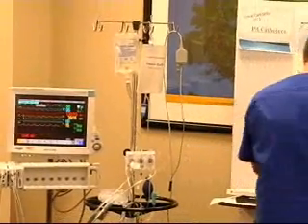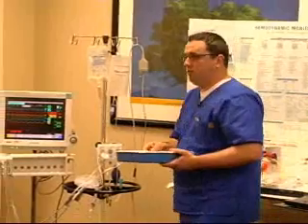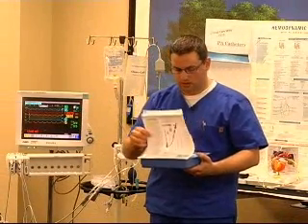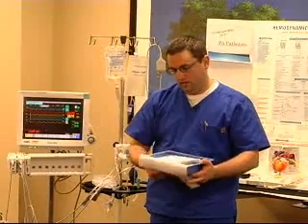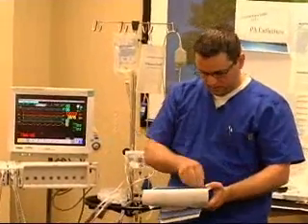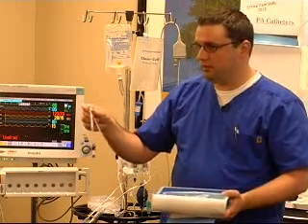So other than that, full drape is recommended, of course. This is a central line insertion, so full drape of the patient would be ideal. Whenever they open this up, the main parts we're going to be using, this is what's going to be inserted in the patient.